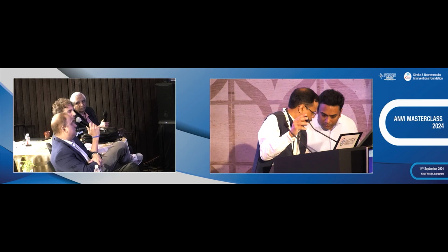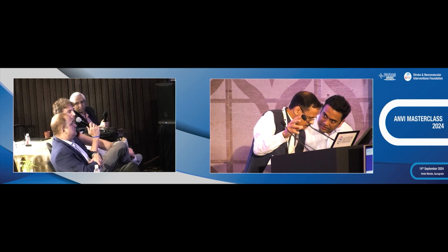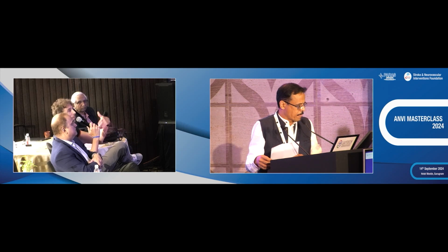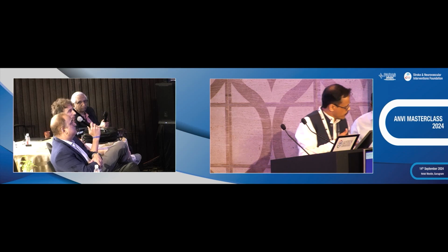And if you hear the Chinese guys that are doing a lot of ICAD, and they compare aspiration with stent retriever, again, the stent retriever is much more efficient to clean the ICAD than the aspiration. So I think we still need to debulk, to advise to debulk those lesions, because if you do not, then you send the distal emboli into the circulation.